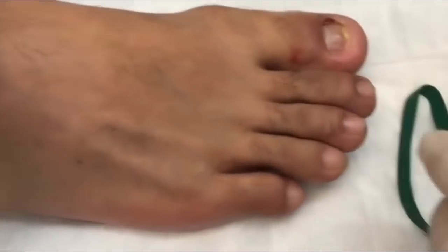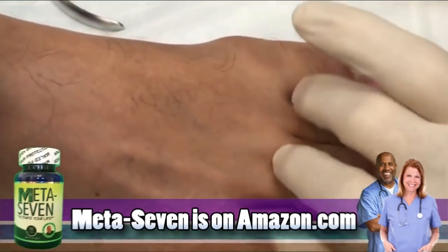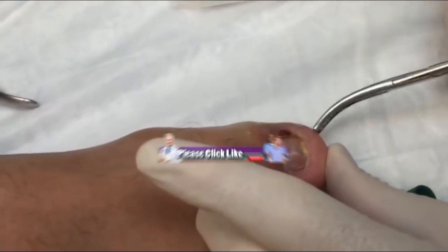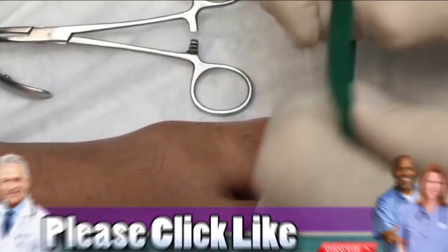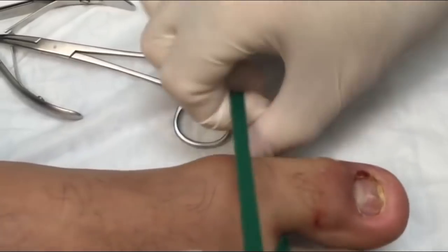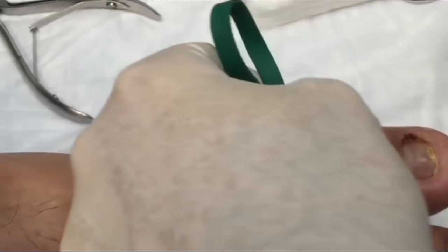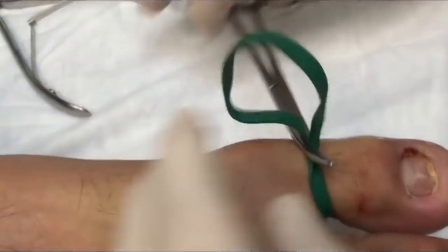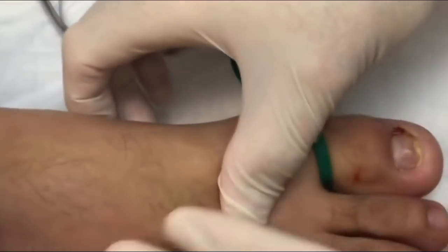Okay, we're back, and we're ready to get started. And we're going to check to see if our anesthesia has worked here. Does this hurt? No. No pain. Good. Here? No. Down here? No. All right. Great. I'm going to put a little rubber band on here so we can reduce our blood flow. A quick procedure so we can do this. Get that out of the way. Okay. Relaje, por favor.